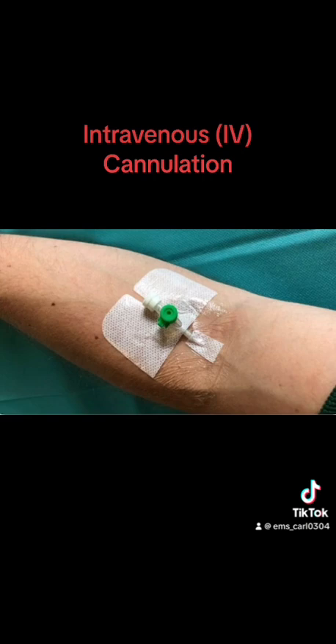Observe any signs of swelling around the site. And remember, once inserted, the cannula should be replaced every 72 to 96 hours.